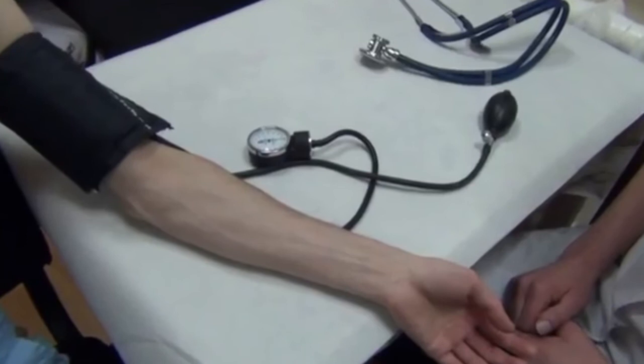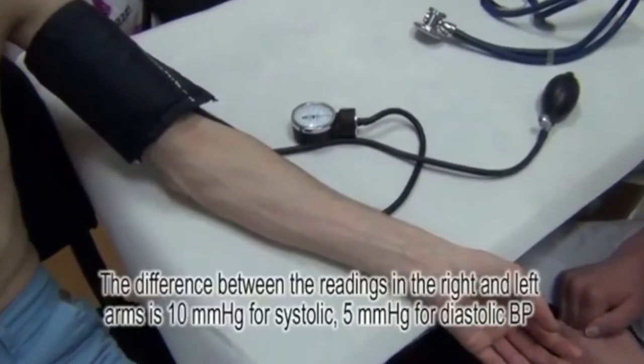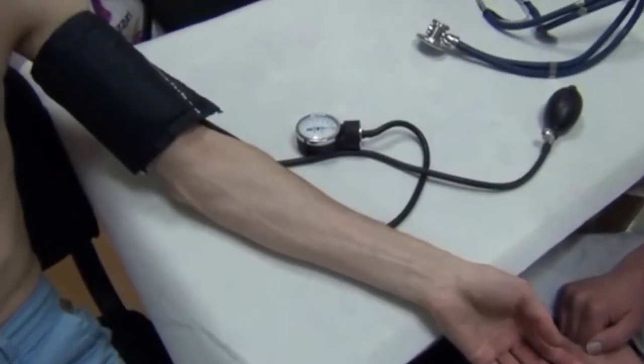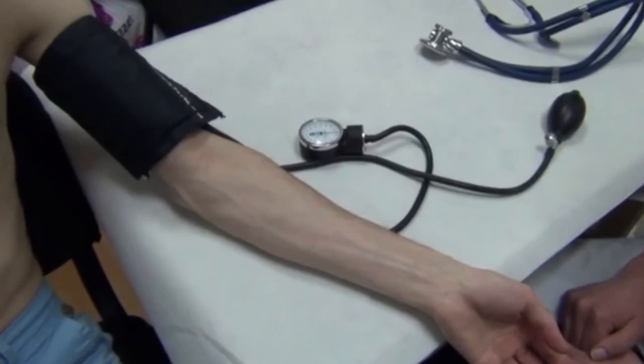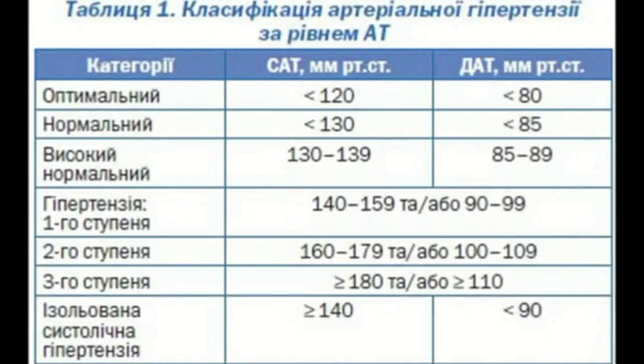At the first contact with the patient, we should measure blood pressure on both arms and compare the results. The results should be practically equal. The normal acceptable difference between two arms should be no more than 10 mmHg for systolic blood pressure and no more than 5 mmHg for diastolic blood pressure.